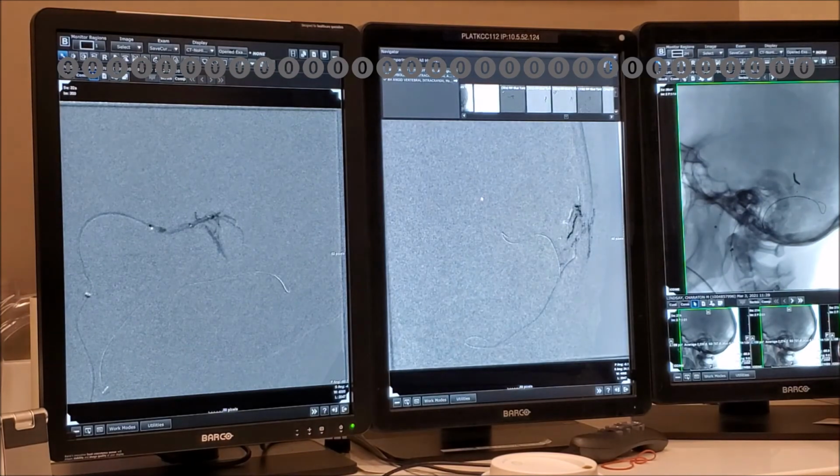So this is a bigger one. I don't know why the media looks like this. Here we use the bigger one. Something is funny, how the injection is being diluted.